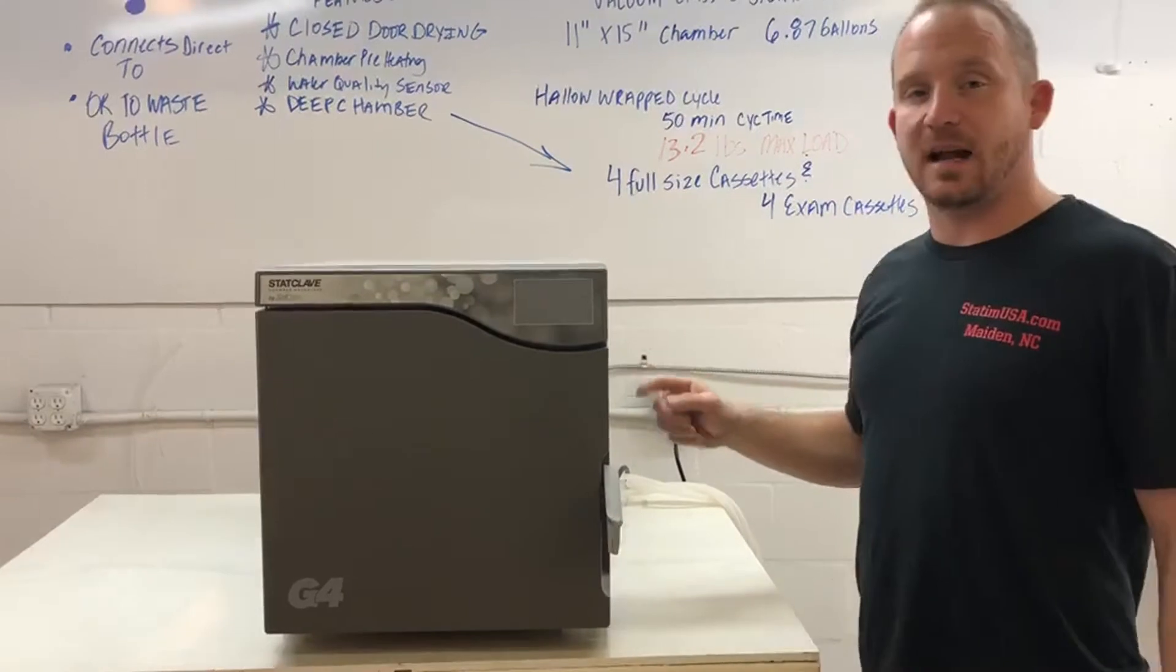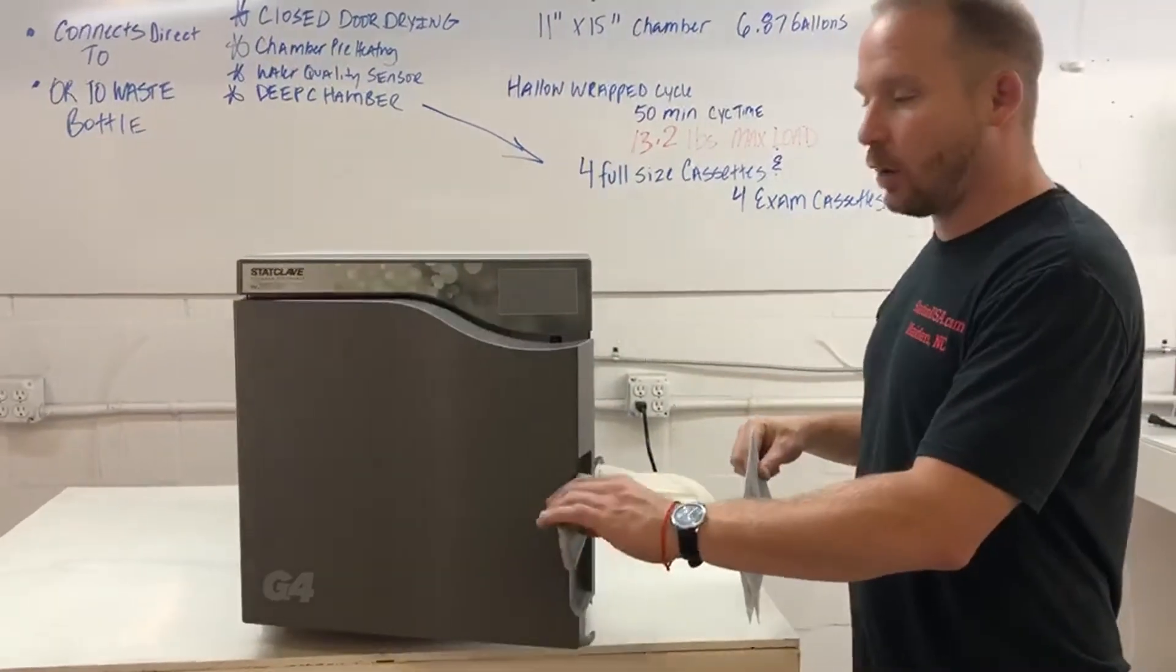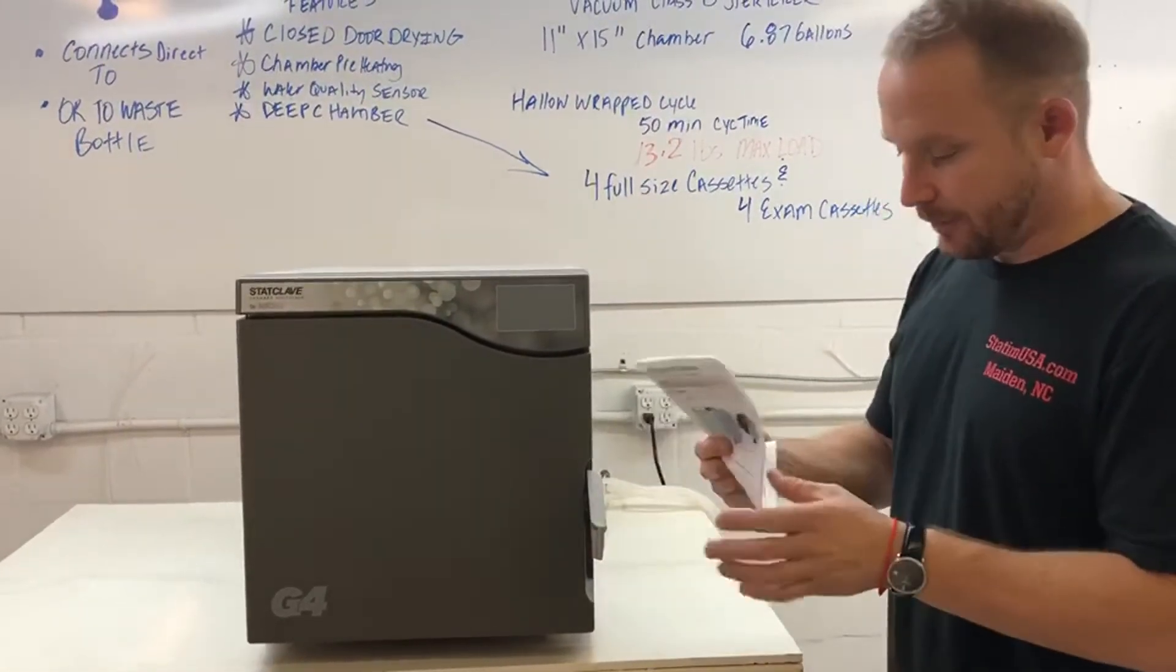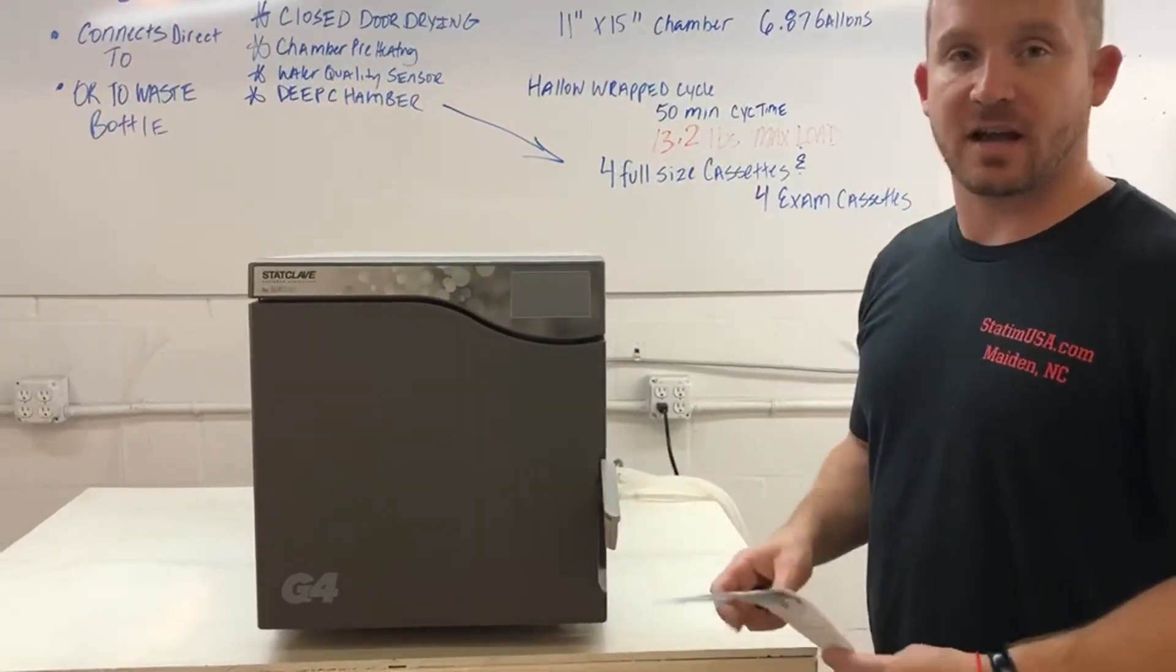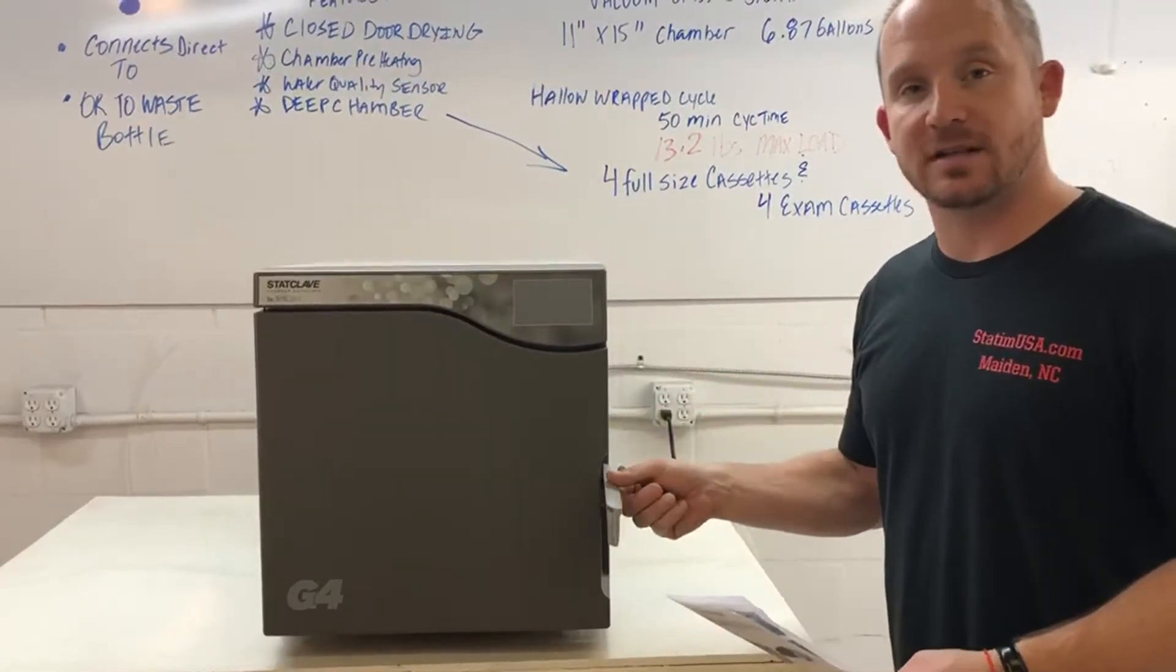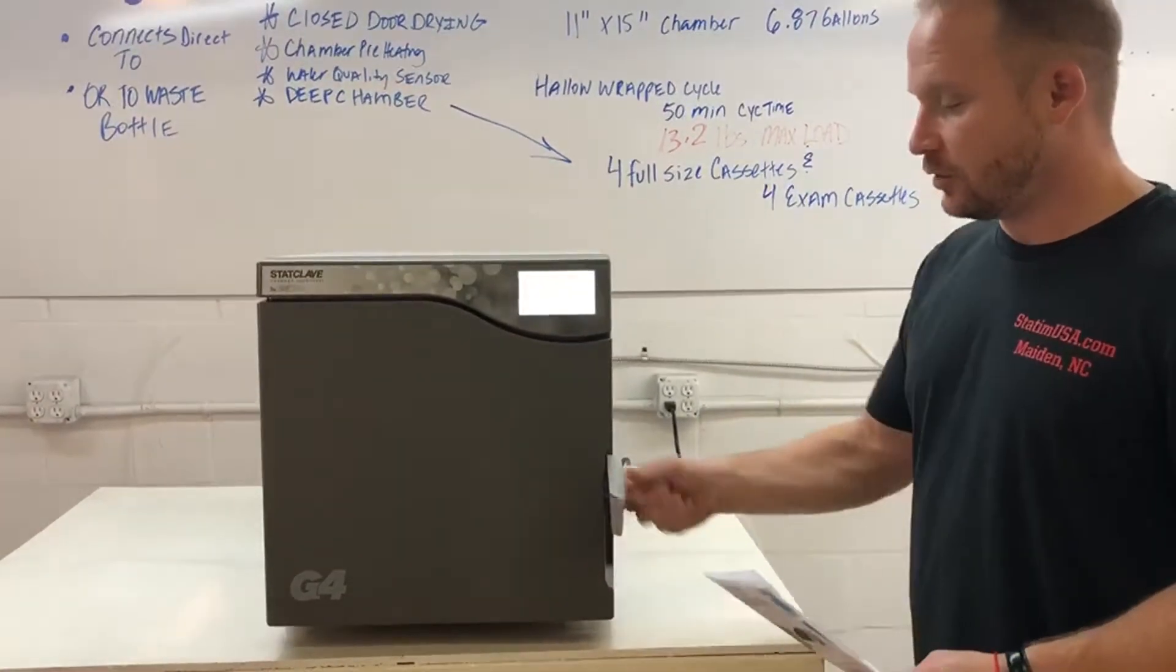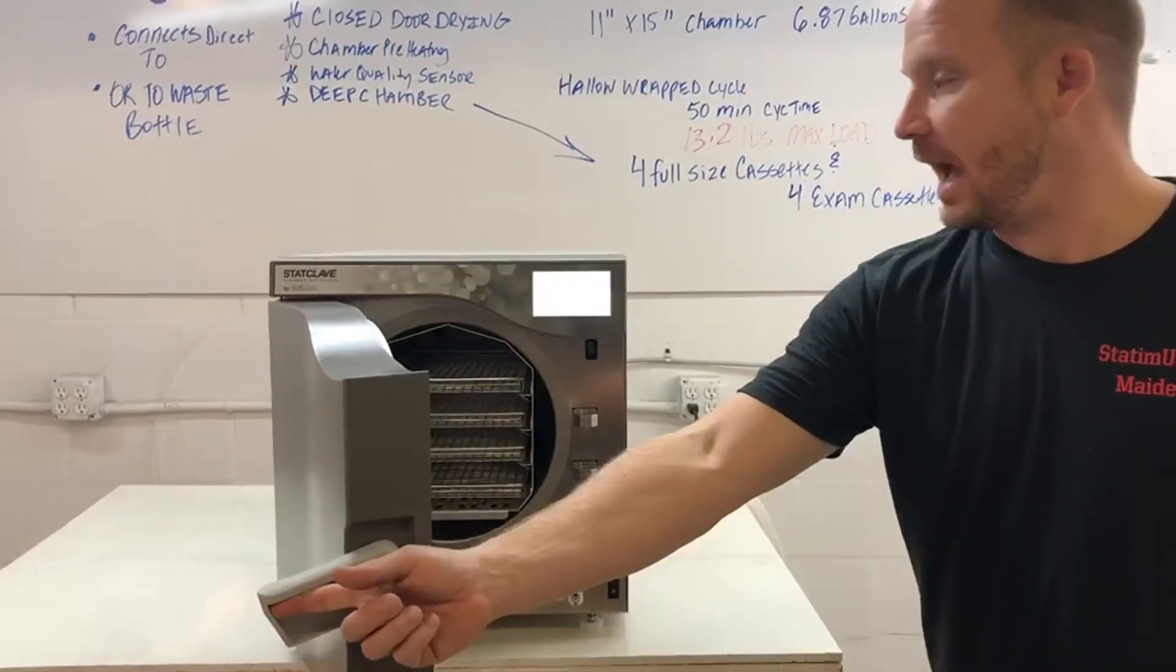So upon setup, two things are very important. One, keep the door open when you initially turn the unit on. And two, I'll refer to the diagram, we have to run a hollow unwrap cycle. So again, make sure that the door is open when you power the unit on, like so. Door open. That way it can grab the atmospheric pressure.